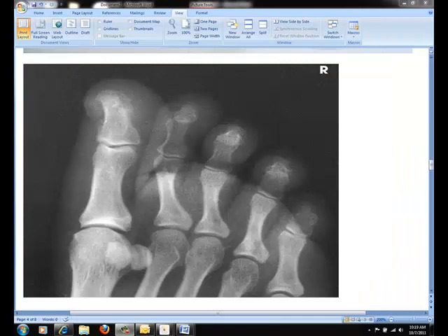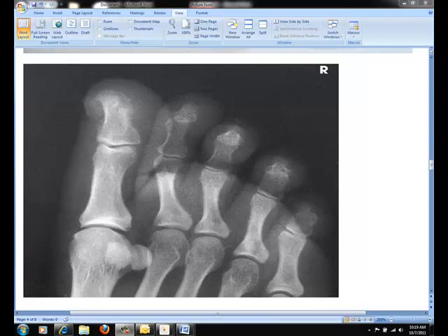The AP oblique projection will show similar structures to the AP projection. However, the distal portion of the metatarsal should be rotated medially, as seen here.